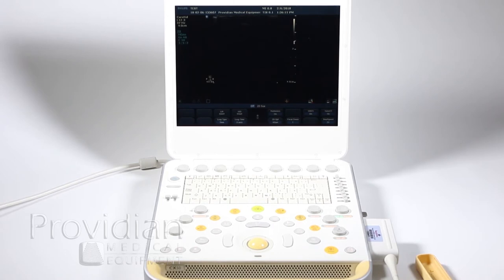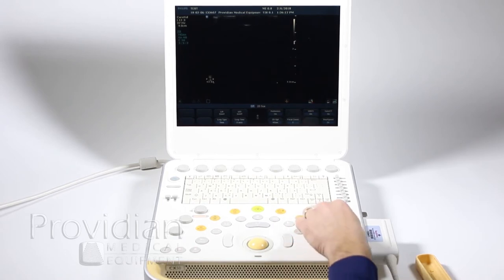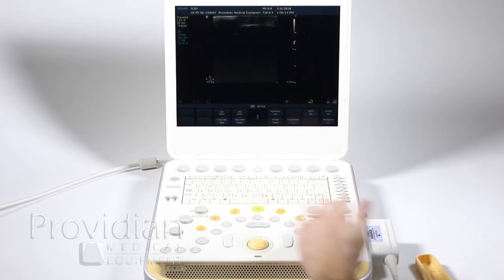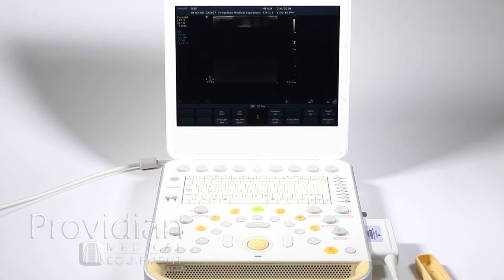Now I'm ready to go. I can just start scanning, and like we said in the previous video, you can change your gain and use all of those controls to optimize your image.